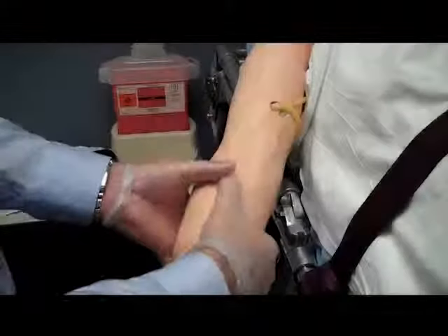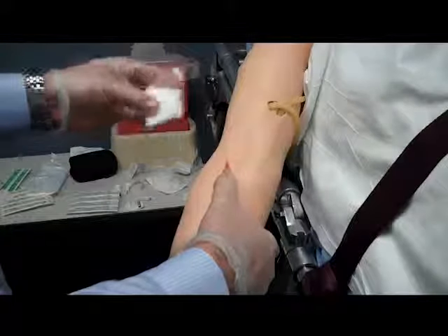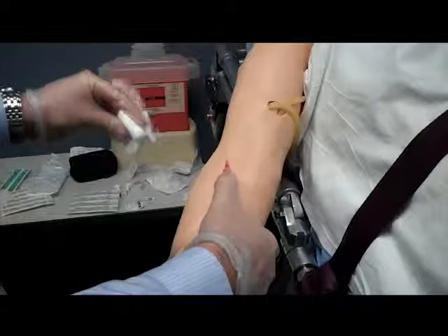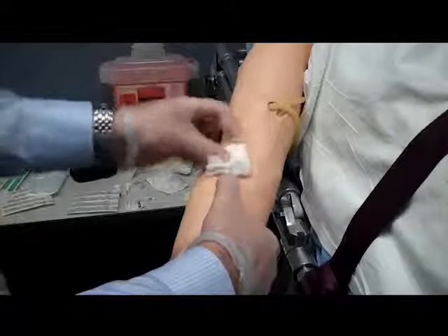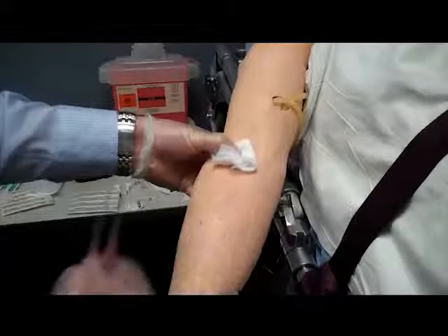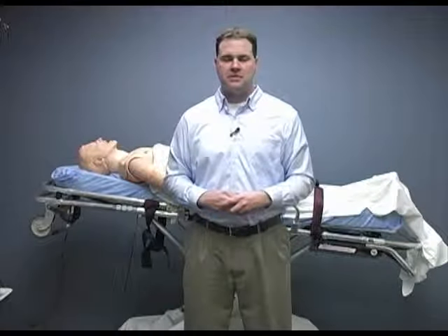When all the tape is removed and the fluid has been stopped, you can now use your 4x4 and cover the puncture site while your other hand grasps the hub of the catheter. With one smooth movement, pull out the catheter and then apply pressure to the puncture site once the catheter is out. We can then apply pressure to the puncture site with our hand or tape the dressing in place. Make sure you dispose of all biohazard properly.